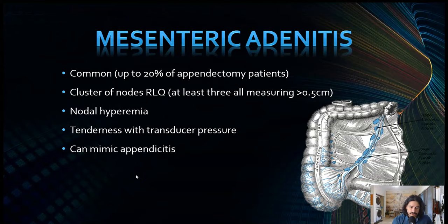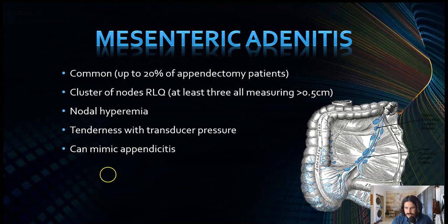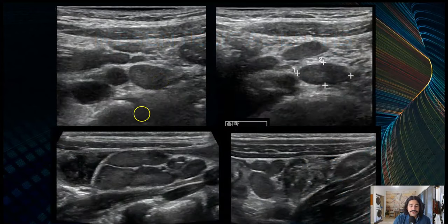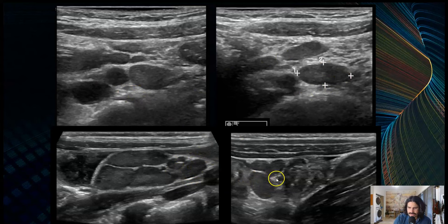Mesenteric adenitis is a diagnosis of exclusion — everything else is normal, no ileitis, no appendicitis, no colitis. You'll notice enlarged lymph nodes specifically in the right lower quadrant, usually a cluster greater than five millimeters. They will have hyperemia, and there can be tenderness when you press with the transducer. It can mimic appendicitis; in fact, 20% of patients with appendicitis also have mesenteric adenitis. Here you see the psoas muscle, iliac vessels, and a little cluster of lymph nodes — if you put color Doppler there, they will light up.